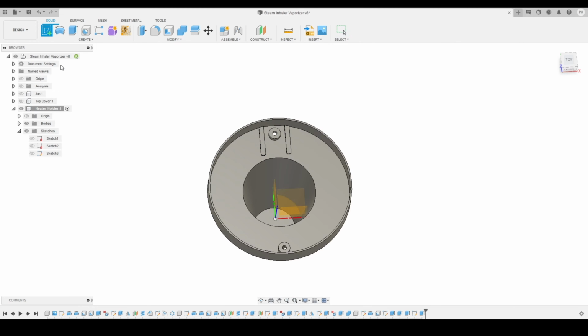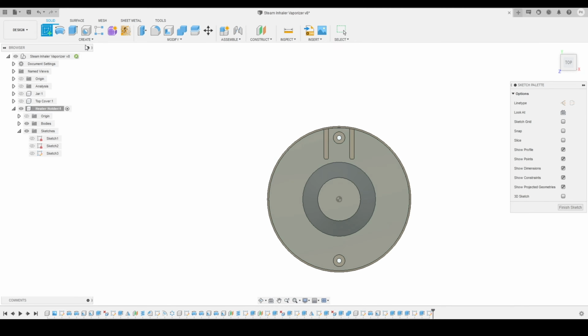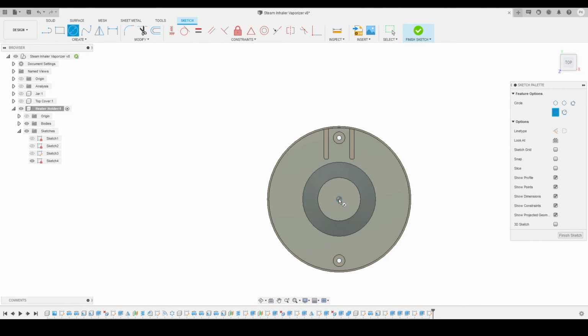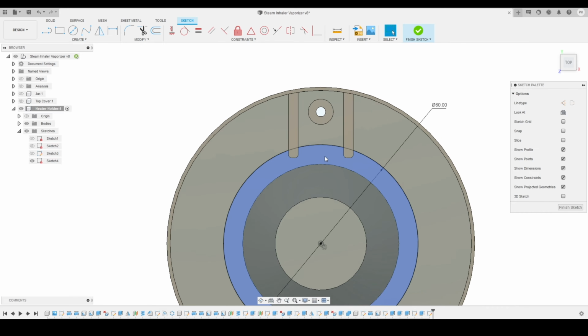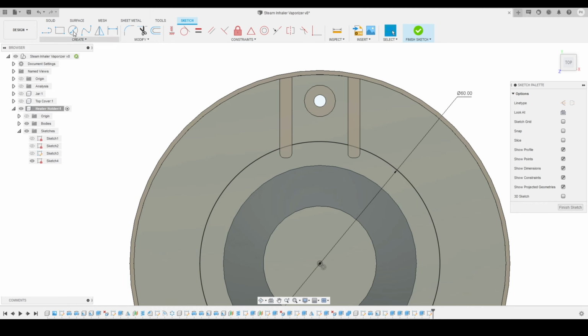Now I will go on to create a sketch and select this face as a sketch plane, and now I will create a circle like this. Here you can see, and I will define the diameter of this circle. So this one I just want to keep 50, and sorry, I think 60 will be good. And then I will select the circle. Also I will create one more circle. Before that I will just convert that to construction line.